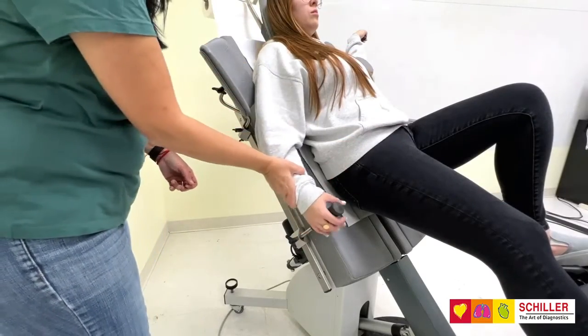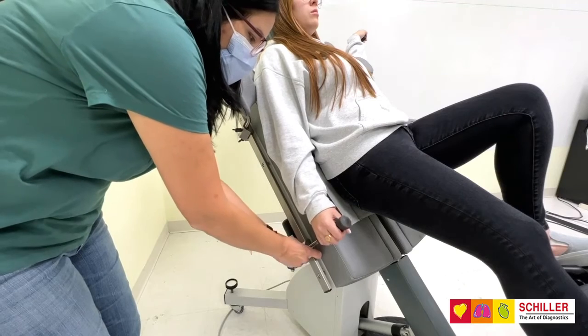The right handlebar is used for additional patient support and can be adjusted manually.